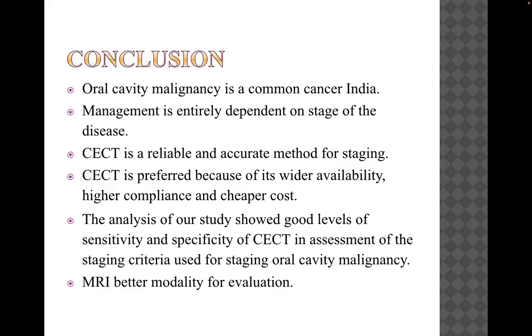Conclusion. Oral cavity malignancy is a common cancer in India. Management is entirely dependent on the stage of the disease. CECT is a reliable and accurate method for staging. CECT is preferred because of its wider availability, higher compliance, and cheaper cost. The analysis of our study showed good levels of sensitivity and specificity of CECT in assessment of the staging criteria used for staging oral cavity malignancy. MRI is the better modality for evaluation.